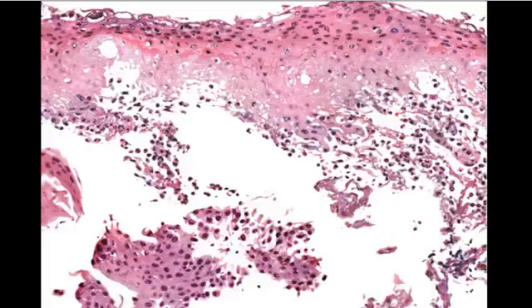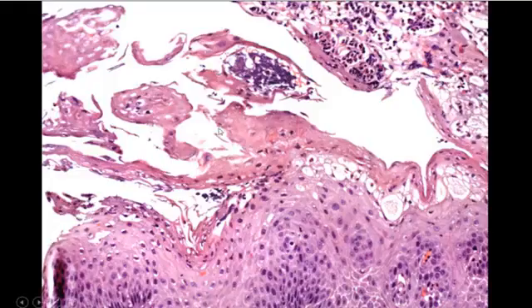And of course, when I see neutrophils, I get worried about Candida, and I'll do a fungal stain, but it's always negative. Here again, you can see this necrotic red stuff on the top, blue regenerative stuff underneath it, and then there's fields of neutrophils here. That's sloughing esophagitis or esophagitis dessecans superficialis, if you want to be fancy.